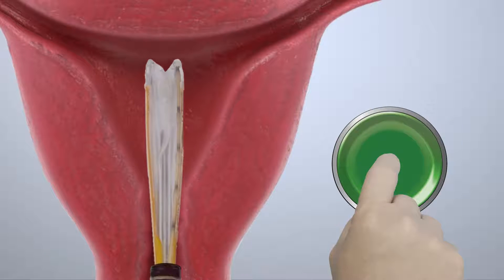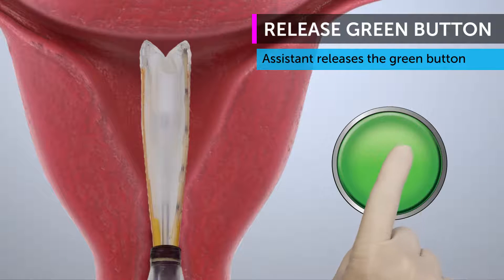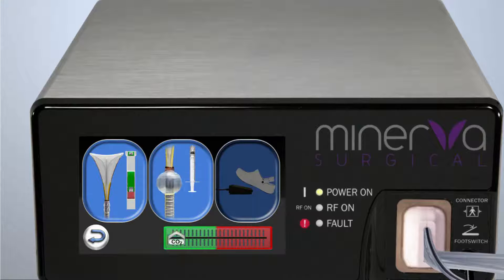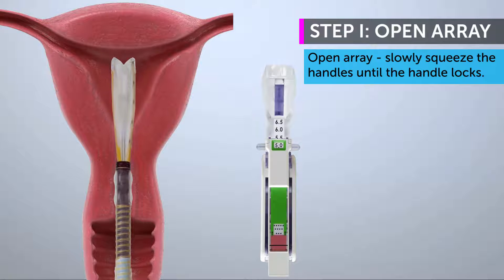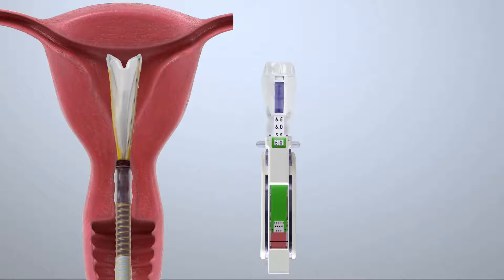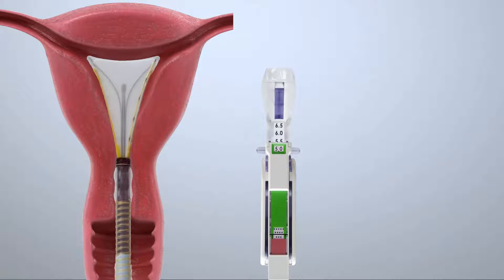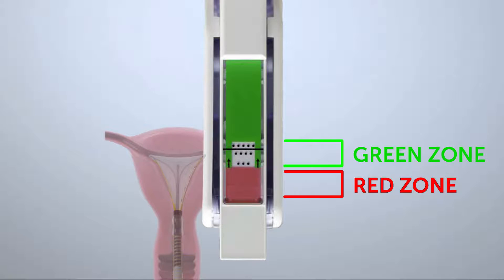Once the device touches the fundus, the physician instructs the assistant to release the green button on the controller. Follow the three steps that are flashing on the screen of the controller. Open the array by slowly squeezing the handles together while gently moving the handpiece approximately one-half centimeter to and from the fundus until the handle locks. Confirm the array opening indicator line is in the green zone.